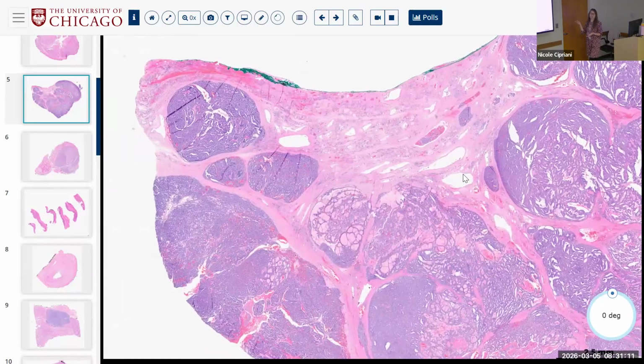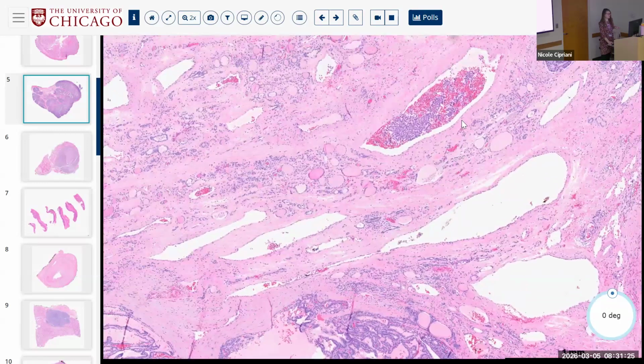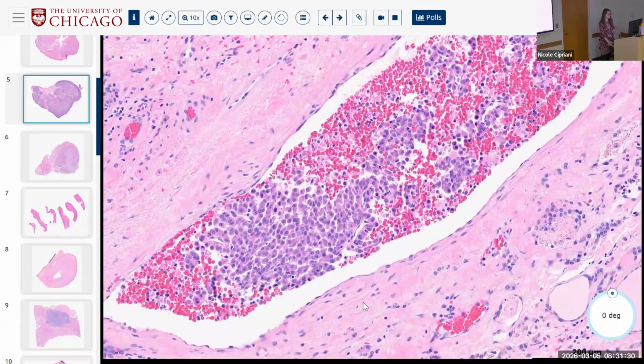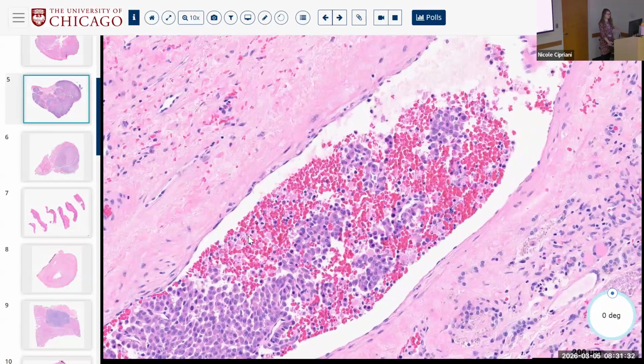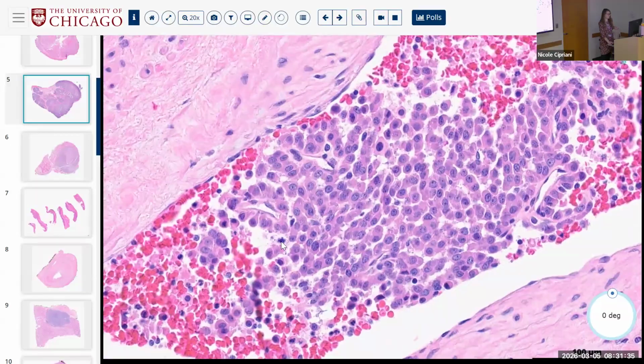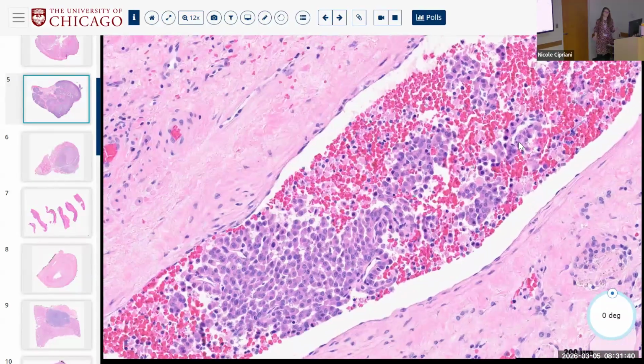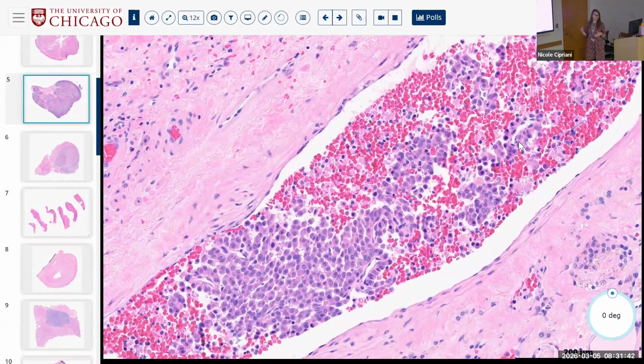So how would you call this tumor? Maybe widely invasive or at least angioinvasive. Right, so then you're starting to think about maybe this is more than just minimally invasive. So maybe you're thinking about angioinvasion because of things like this. Yeah, I don't know if you guys saw this, but there's a thin walled vessel, right, with some fragmented tumor cells in the lumen. Now the question you have to ask here is is this true angioinvasion or fragmentation of tumor, right, that floated off into a vessel?